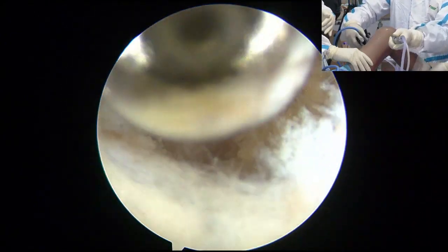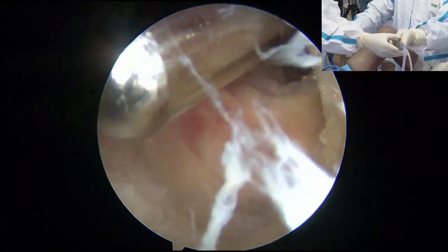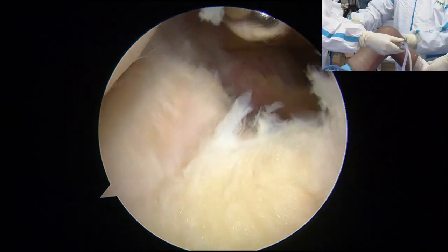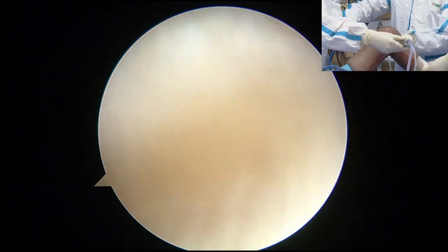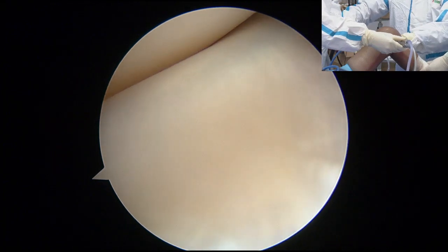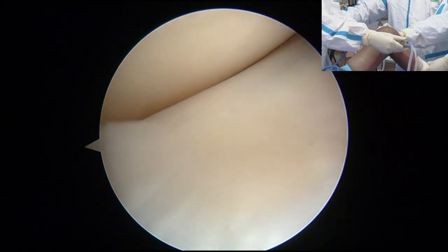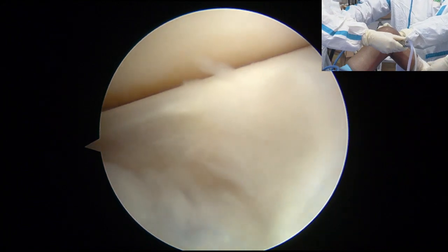Okay, here I go to the lateral side. Here, so turn your scope slowly like that way. Okay, you see lateral side. And you come this way, you see lateral meniscus. This is the lateral meniscus. And then you go this area, you can see the popliteus coming. Then we immediately see the popliteus. So popliteus is here. You see, it's coming here. You see that hiatus? You see that?